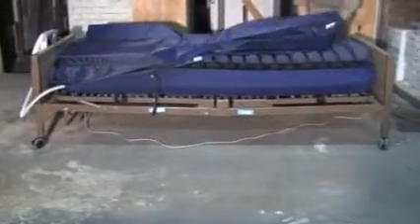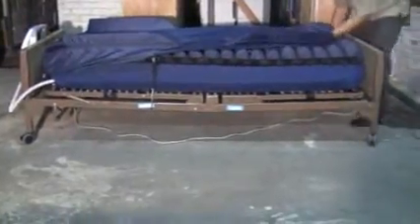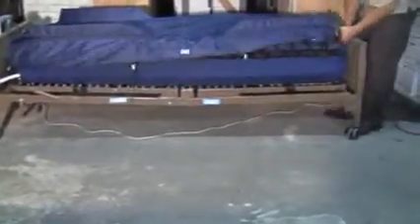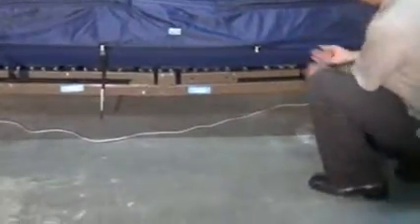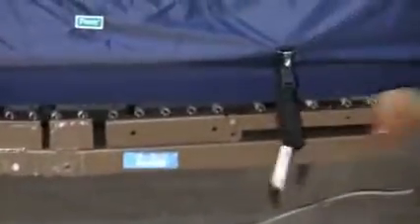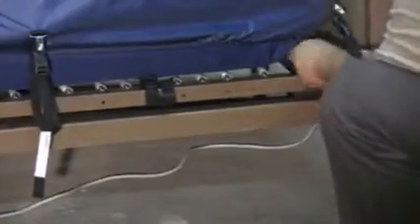Once your bolster top sheet is open, you will completely cover your low air loss mattress. After your safety bolster sheet has been placed, you may go ahead and strap down your safety bolster sheet to your bed deck in order to ensure that the safety bolster sheet does not move for patient safety.